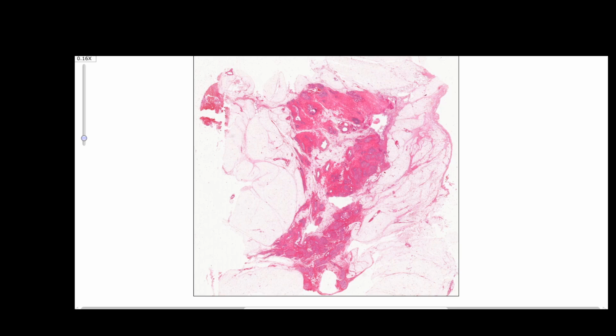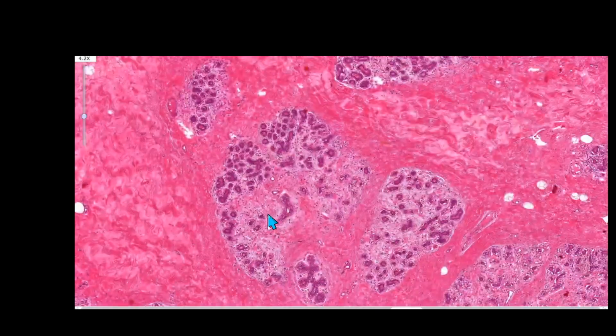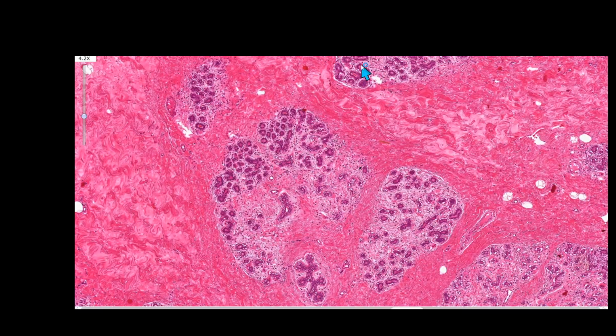This is a large format thin section histopathology slice measuring 10 by 8 centimeters from the surgical specimen of case 95. Let's analyze the findings by looking at the normal tissue. What is striking is the very red interlobular connective tissue. We can call it extralobular.